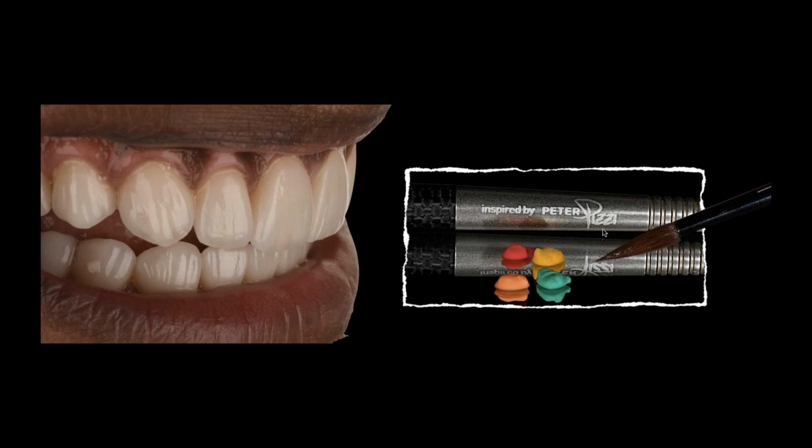And why do I want white? Because if I really want to get to an OM1 or an OM3 kind of a case, I want as much whiter brightness on the inside as I can have. And then as I filter out, I'm just getting more and more translucent. So I'm starting white. And the best example is if the doctor asked you for OM3, I start with OM1. I start even whiter and brighter, a white core, a white EC1, or maybe a very bright opacious dentin, and then even brighter dentin. And then my next dentin would get more translucent, but still similar brightness.